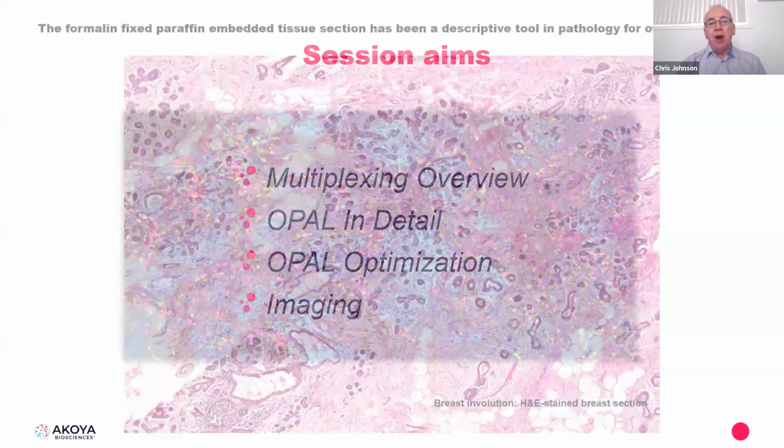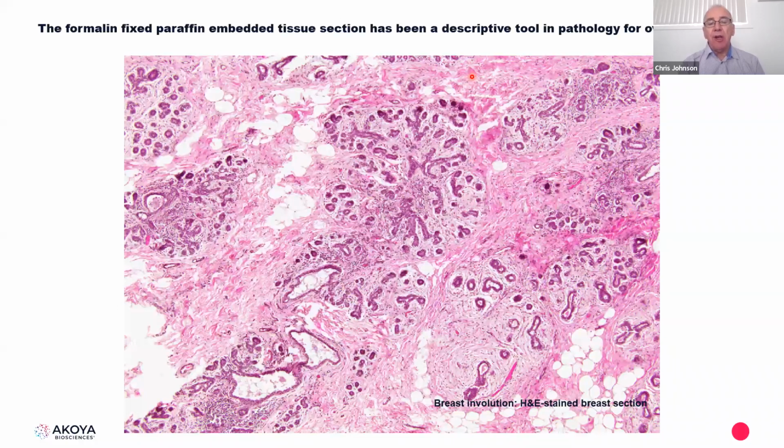Okay, I'm sure you'll all recognize that. It's a hematoxylin and eosin section. And you recognize it because a lot of you will understand the tissue makeup. Histology generally is a very descriptive and morphologically based tool, and has been for probably the last 150 years, and it forms an important backbone to general pathology and tissue analysis.